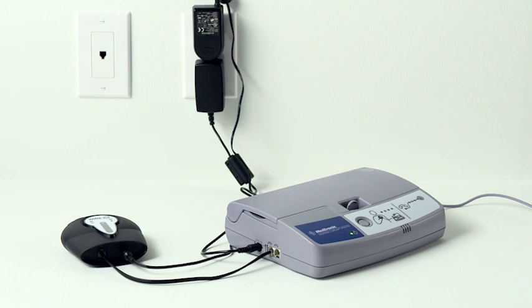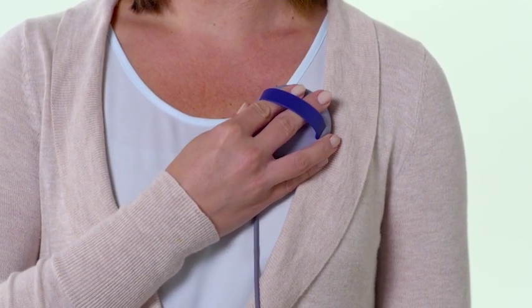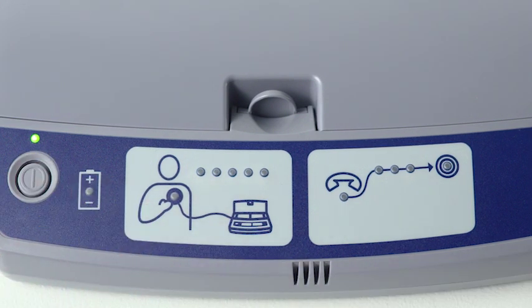With the unit powered on, you're now ready to test the new components. The wonderful thing is that once the cellular accessory is set up, you will use your existing monitor in exactly the same way you always have. So go ahead and place the antenna over your heart device and press the monitor's button to send your heart device information to your clinic.